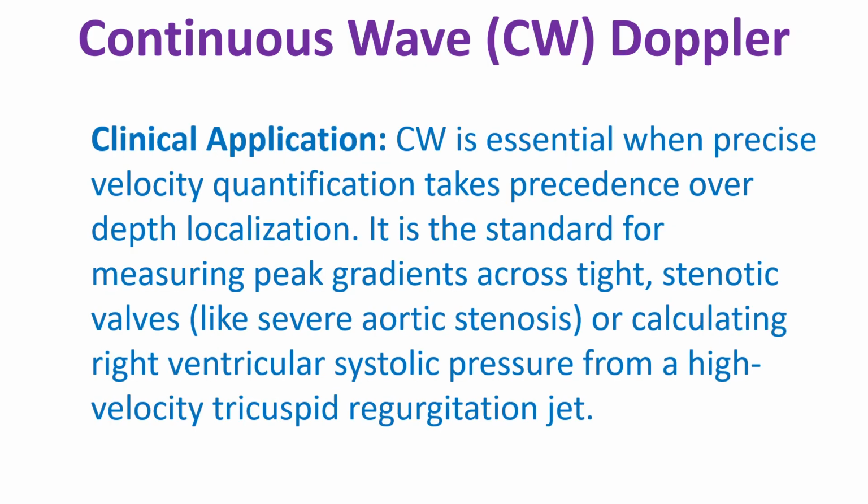Clinical application. CW is essential when precise velocity quantification takes precedence over depth localization. It is the standard for measuring peak gradients across tight stenotic valves like severe aortic stenosis, or calculating right ventricular systolic pressure from a high velocity tricuspid regurgitation jet.